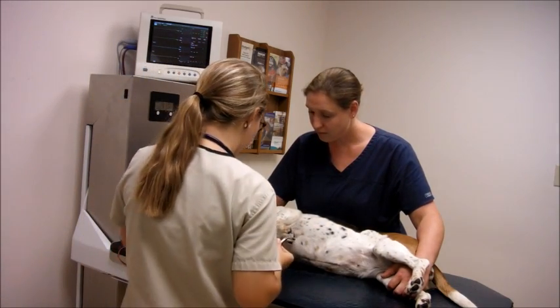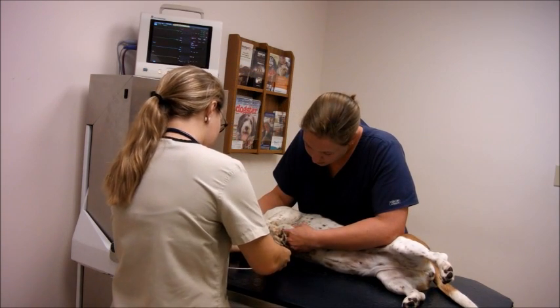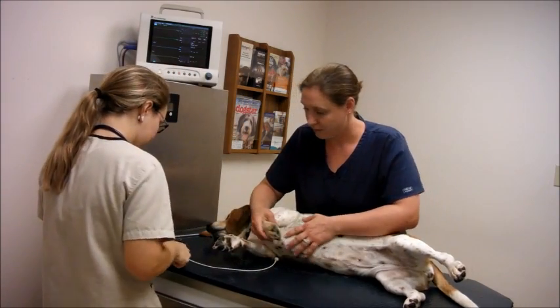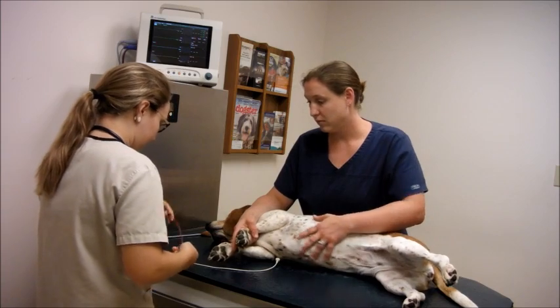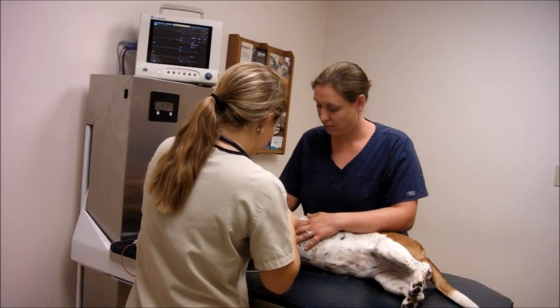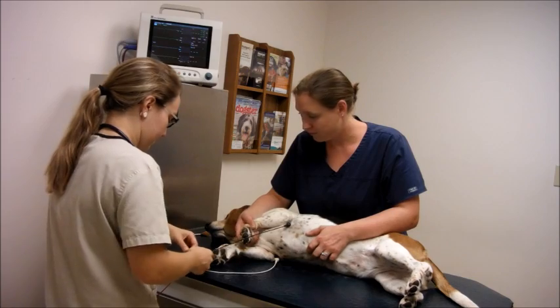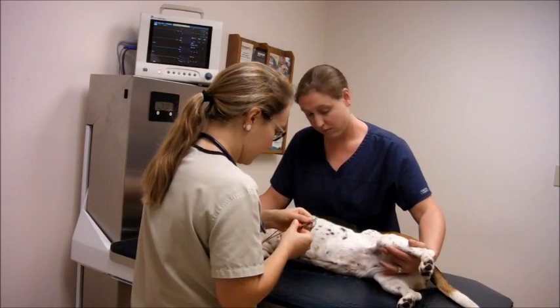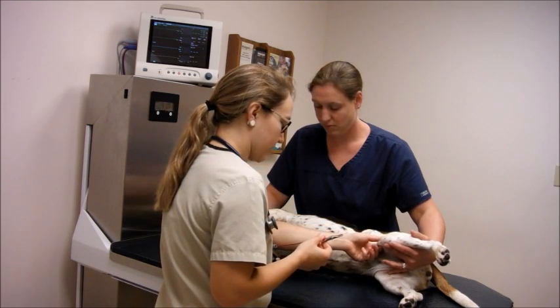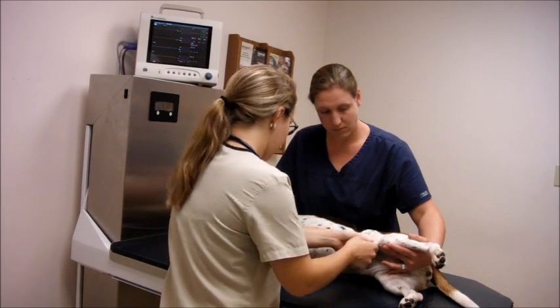I have my white lead, so that's going to go just below the elbow, closer to the heart. I'm going to pull some of the skin right there by the elbow and place that. Now I'm going to hook up my black lead, and that's going to go on the left arm, same position — right on the skin by the elbow, closest to the heart. And then I'm going to hook right just above the stifle joint, closer to the body.